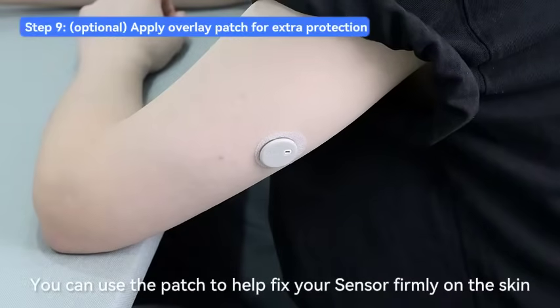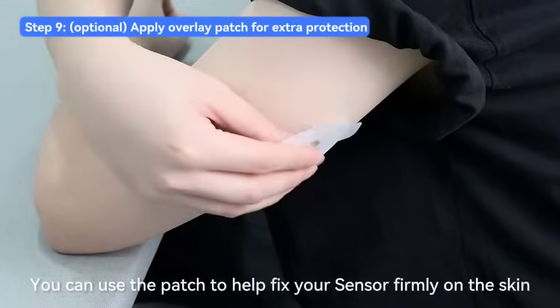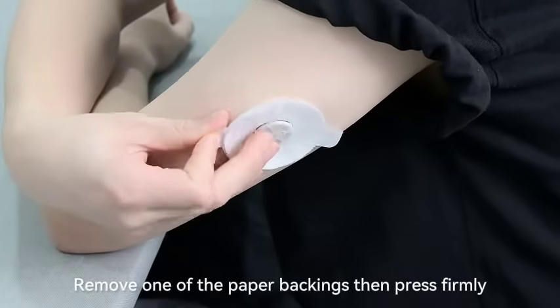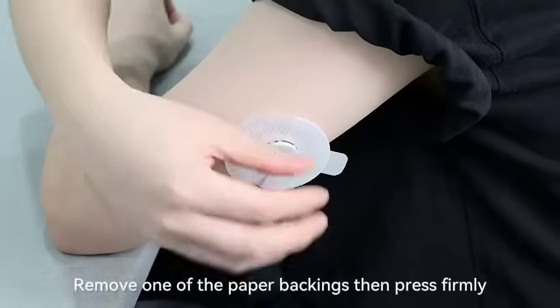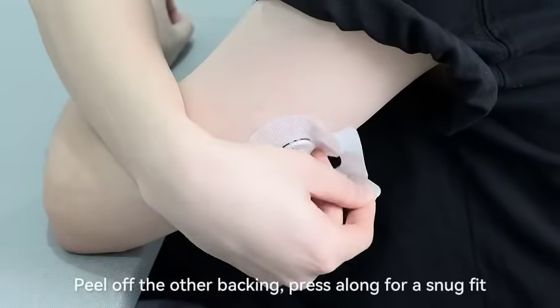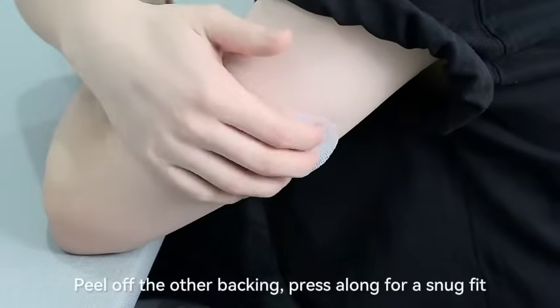You can use the patch to help fix your sensor firmly on the skin. Align the patch center to the applied sensor. Remove one of the paper backings then press firmly. Peel off the other backing and press along for a snug fit.